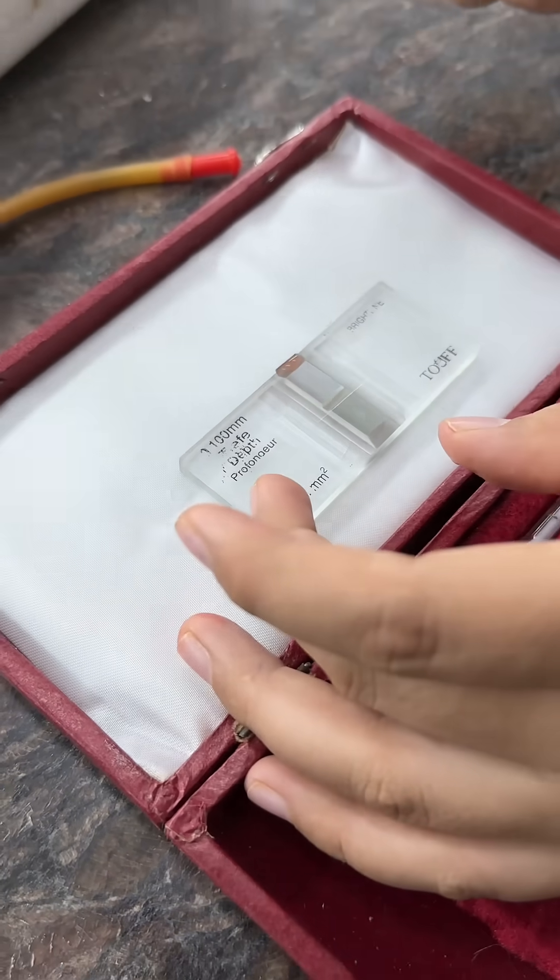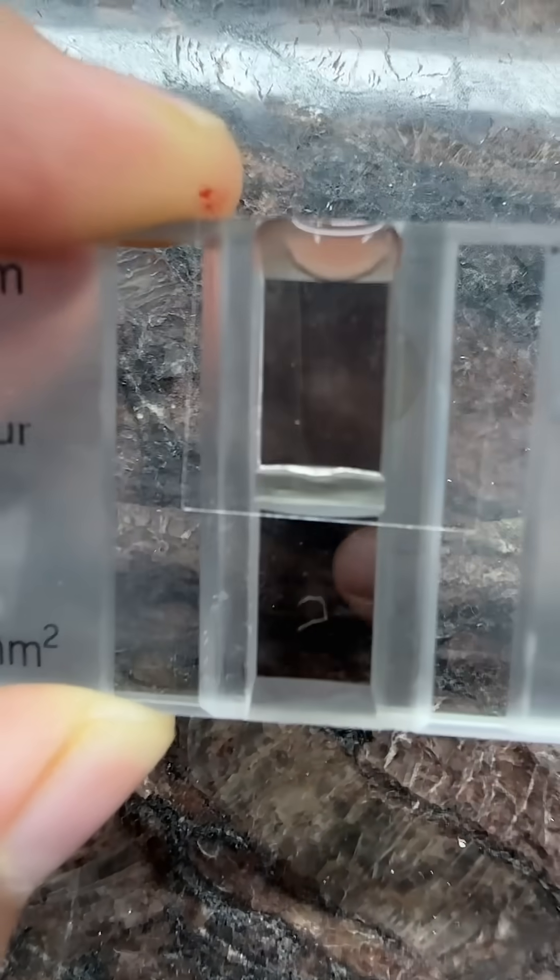Then focus Neubauer chamber under 40x and count cells in these medium sized squares.